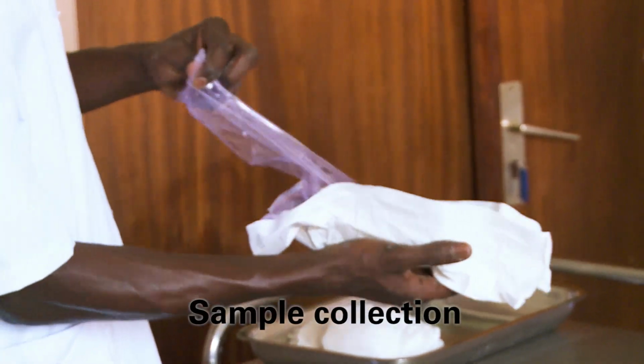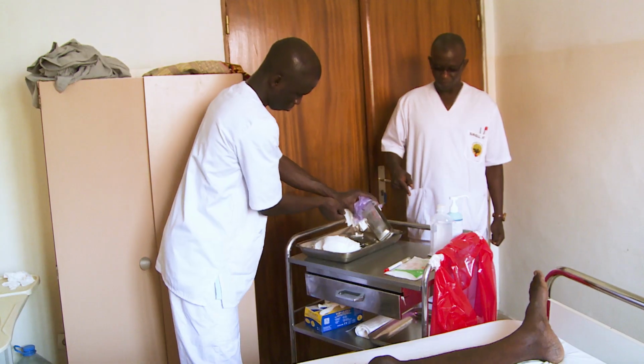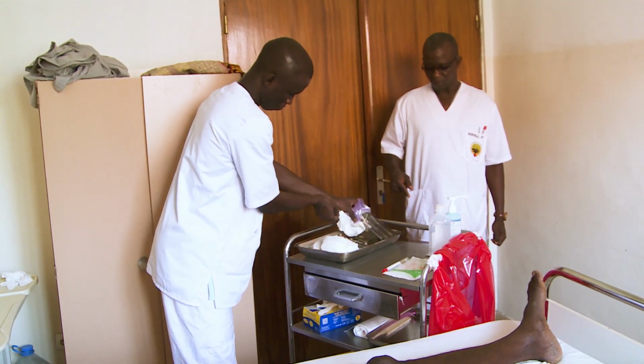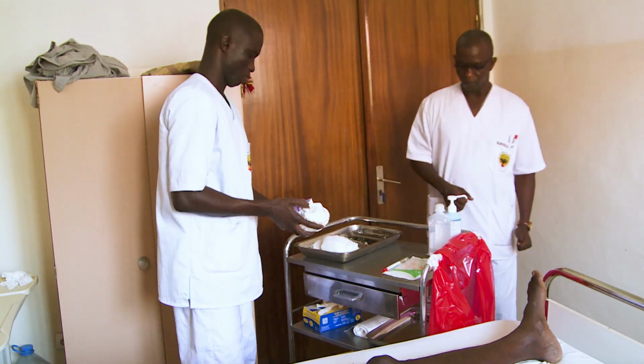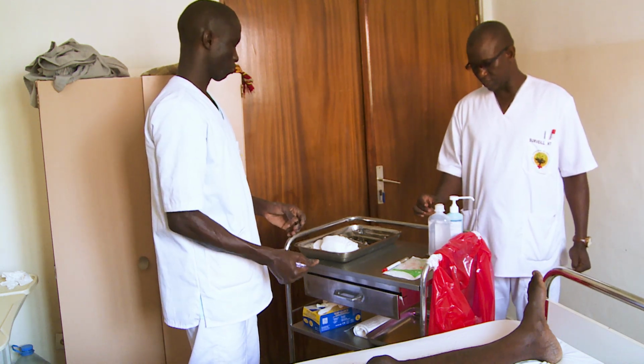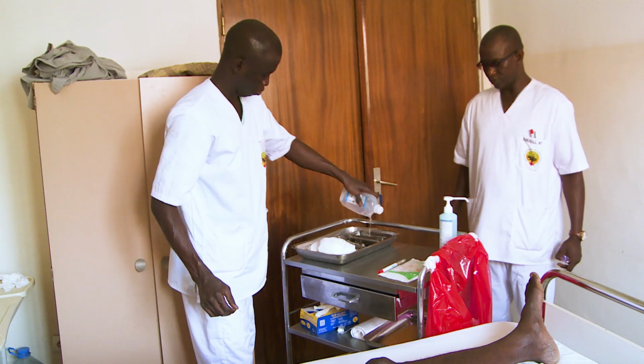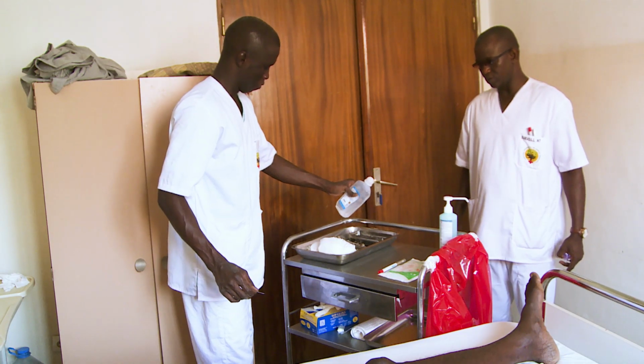Open the sterile pack without touching the interior or sterile instruments. Empty the sterile forceps, scissors and container onto the sterile field very carefully. Dispose of waste directly into the waste bag. Pour the sterile saline directly into the sterile container or pot.